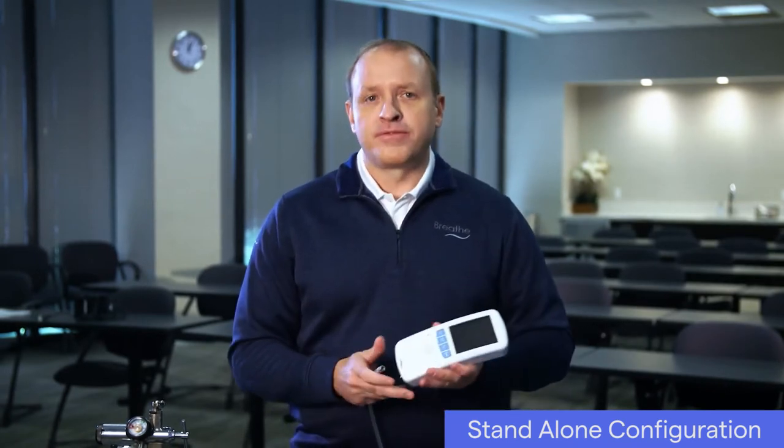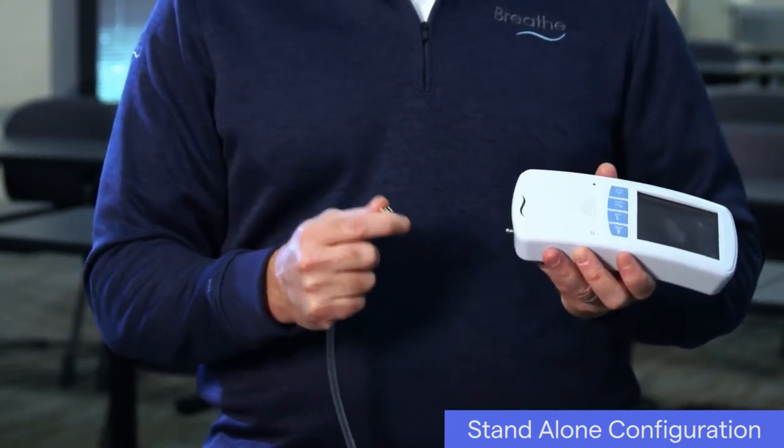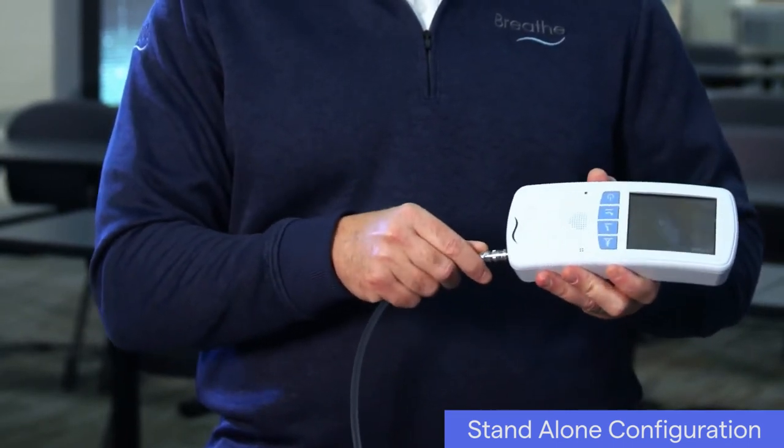You'll want to choose a Breathe Technologies oxygen hose length that is appropriate for your needs. A six-foot hose is included as part of the basic kit. With the ventilator off, connect the oxygen hose to the ventilator by pushing the quick connect end of the hose onto the gas inlet connection on the bottom of the ventilator. When connected, it will click into place.